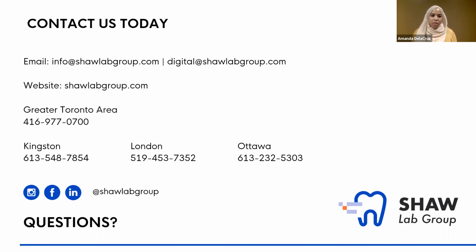All these things are factors that will affect the fit of the crowns. So in the beginning, there's a learning curve. We do recommend, if you're just starting to have an intraoral scanner, that you also send PVS impressions so that you can compare and see the fit. And I find that you learn a lot that way, and you can see some issues we might have.